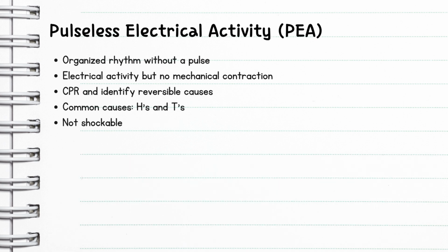So now we're going to talk about pulseless electrical activity, or PEA. I don't have a rhythm on this page because it could look like anything.